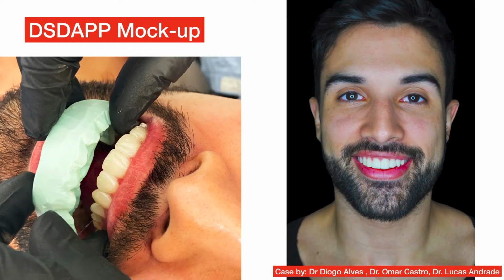An impression of the mock-up was done using addition silicone, and we called the patient. The mold was then filled with bisacryl resin and placed onto the patient's teeth, where no adjustments on the mock-up were needed. When shown to the patient, he instantly made an emotional connection as he saw a natural smile that complemented his facial structure.